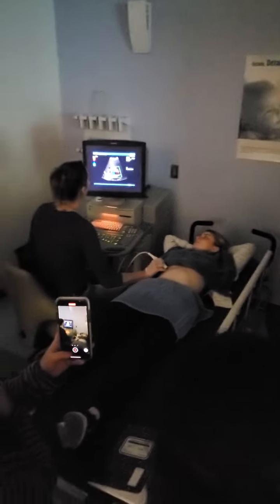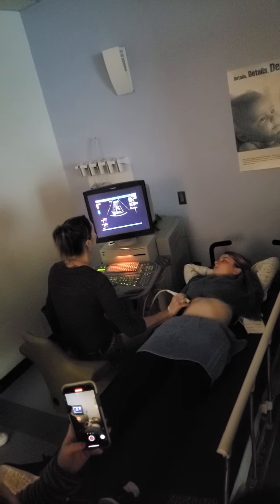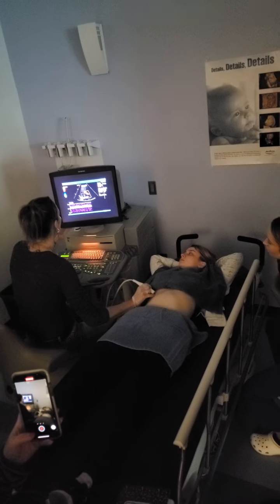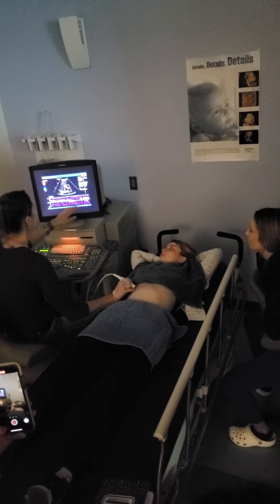The other thing we do is what we call pulse wave. So see, I have this little tiny gate. I can move it around and I can sample all of these different velocities. Go ahead and hold your breath right where it's at. So that's your portal vein. Now go ahead and breathe a couple times. See how it kind of goes away?